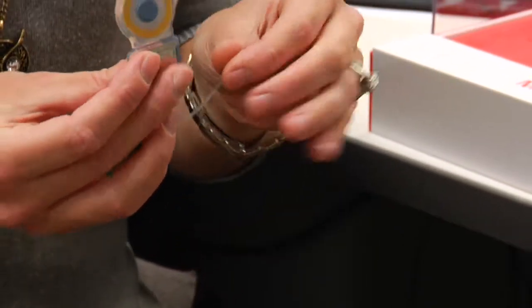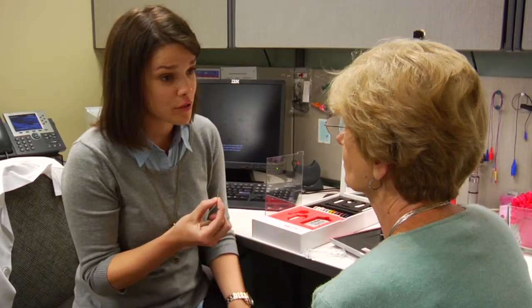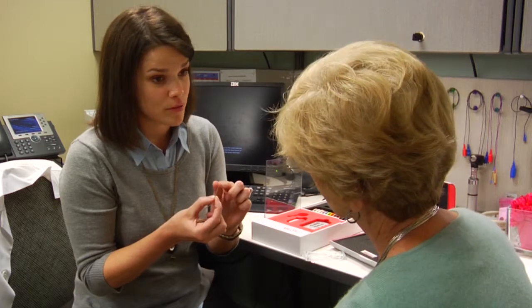This is the internal receiver, and the surgeon will place this electrode array into your cochlea. Each of these electrodes is how you will hear sound.